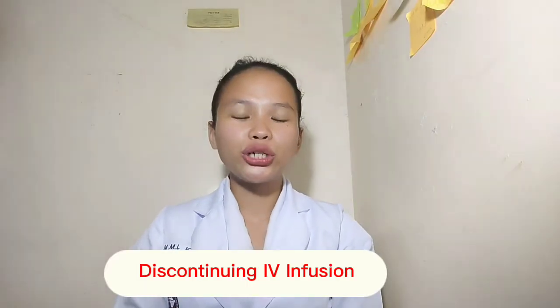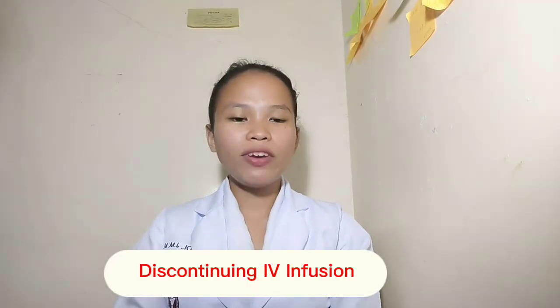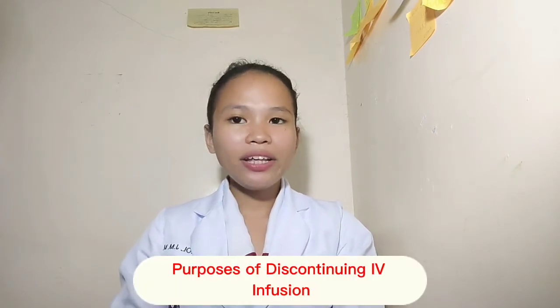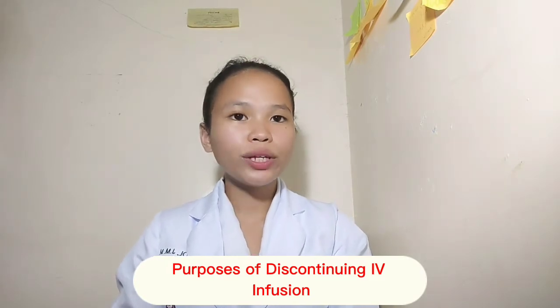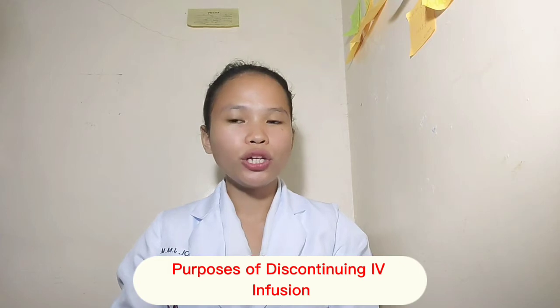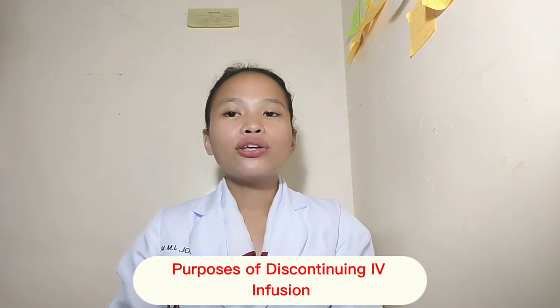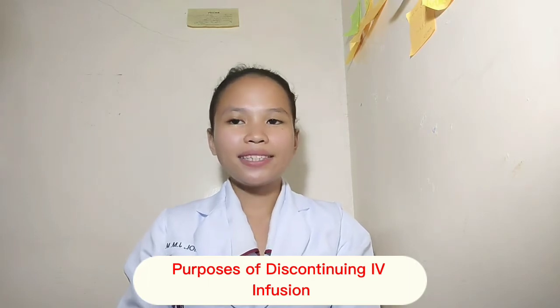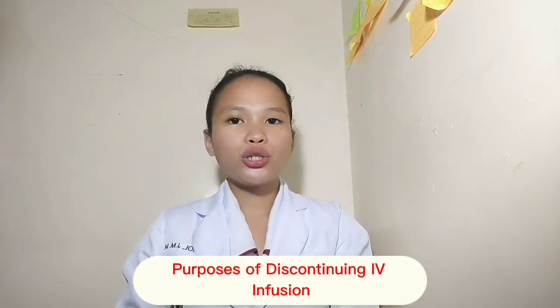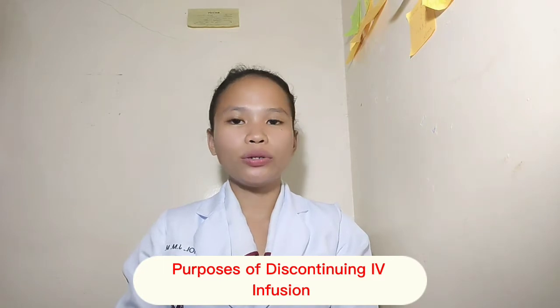And the last procedure, discontinuing of intravenous infusion. Indications: First, the client's oral fluid intake and hydration status are satisfactory so that no further IV solutions are ordered. Second, there is a problem with the infusion that cannot be fixed. Lastly, the medication administered by IV route is no longer required.